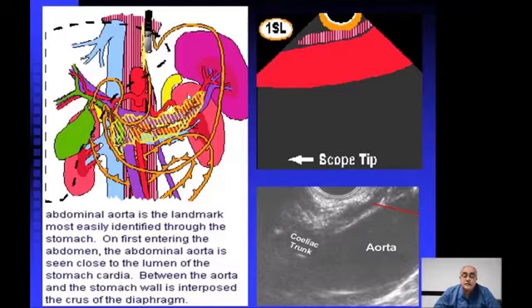of the pancreas. So even the whole pancreas can be seen from the stomach, including the tail at the spleen and the kidney by clockwise rotation, and the body of the pancreas at the level of the celiac axis and the aorta, and the neck of the pancreas as the venous confluence, and the head of the pancreas by anti-clockwise rotation to see the venous confluence and the common bile duct and the pancreatic duct surrounded by the head of the pancreas.